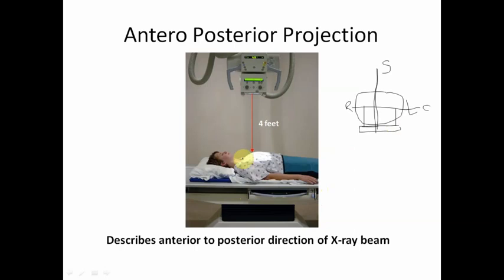This upper border of the cassette should usually be 2 centimeter above the shoulder level. So the cassette should be in this place. Then whatever part is below should be included. You can also mention it should be 2 centimeter above the sternal notch, so that if you keep the upper border of the cassette there, you will be able to include the whole length of the thorax.